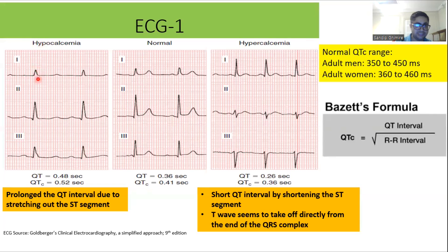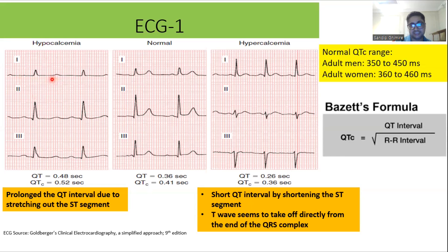Looking at the hypocalcemia ECG, the ST segment is prolonged, leading to a prolonged QT interval — a typical finding in hypocalcemia. One important point: this prolonged QT interval is not due to changes in the T-wave or presence of U-waves as in hypokalemia, but is due to the lengthening or stretching of the ST segment.